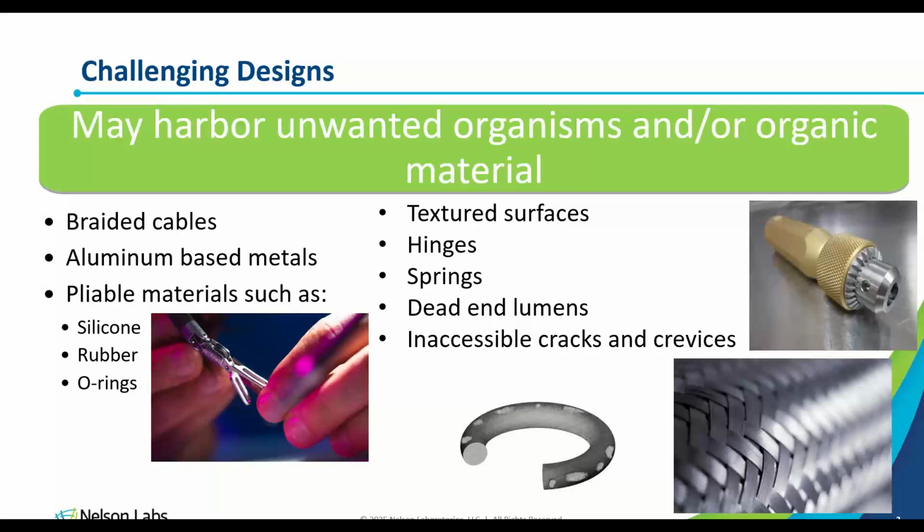With that sort of device, though, I would expect to include ultrasonication during the cleaning process. So you'll recommend in your instructions for use to prepare a detergent in an ultrasonic unit and then fully immerse the device in there and allow the device to remain immersed during the sonication process for 10 to 15 minutes.